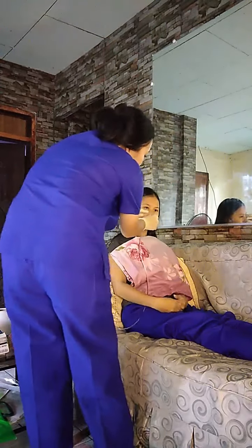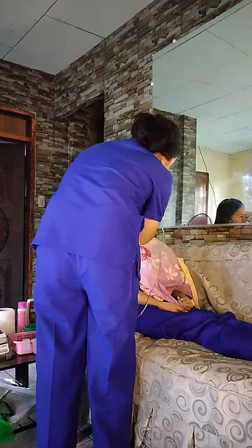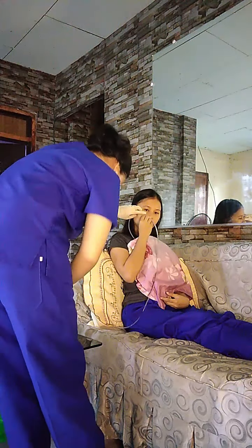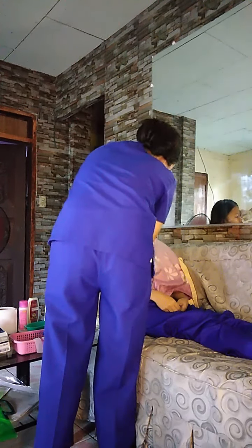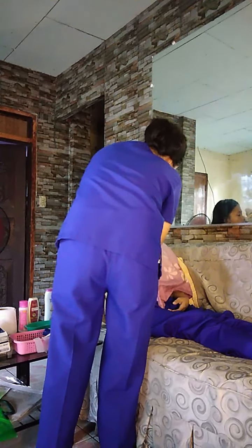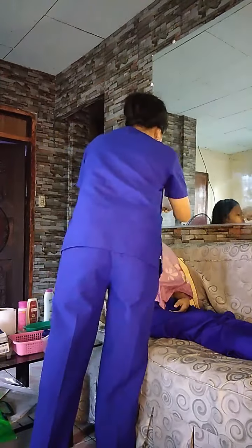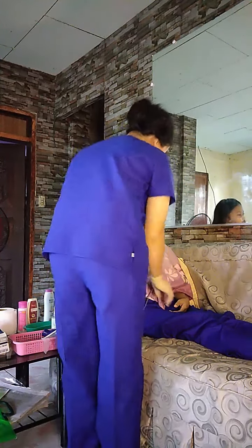Isi-secure ko na yung tubing sa nose bridge ni ma'am. Aalisin ko muna yung ginamit kong mark. And then, lalagyan ko siya ng tape. So, ayan, nilagay ko muna sa nose bridge. And then, secure it with another tape to make sure na hindi mag-withdraw yung tubing.